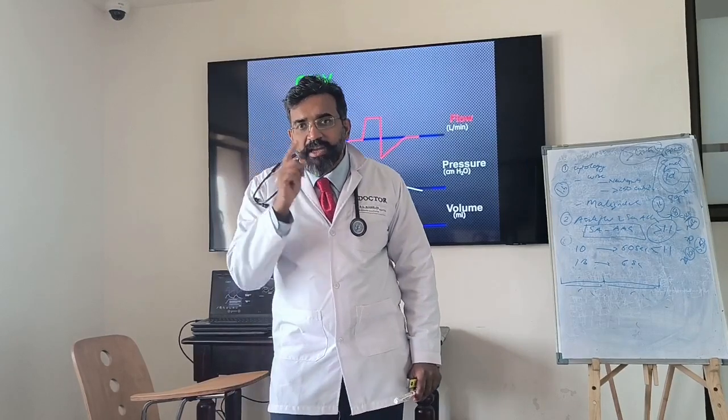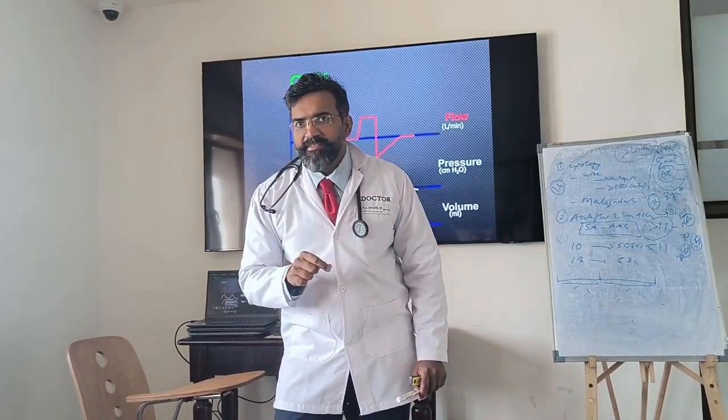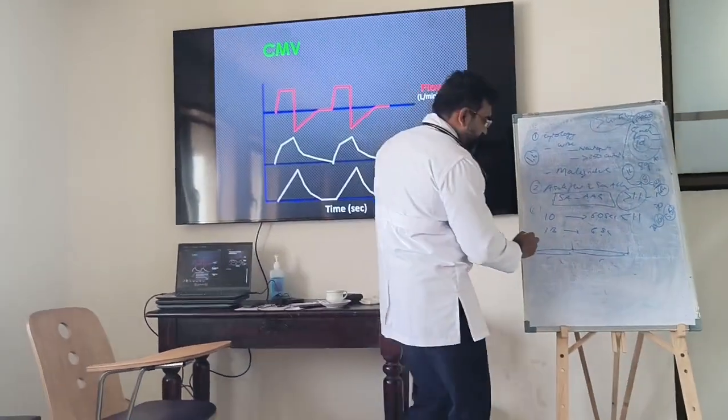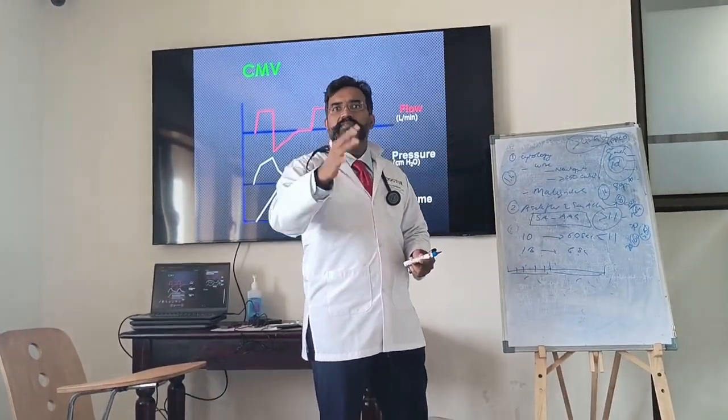So if a patient is breathing and you have not set a trigger, what will happen? The patient might want to take a breath anywhere, but the ventilator will not give the breath.